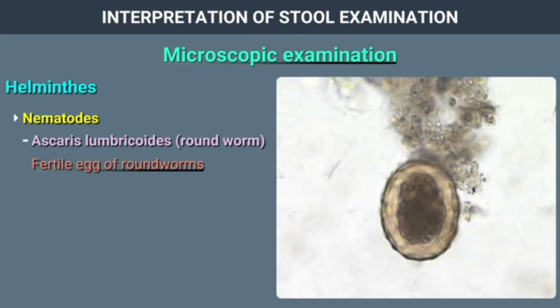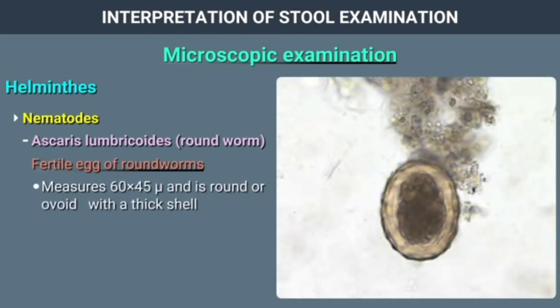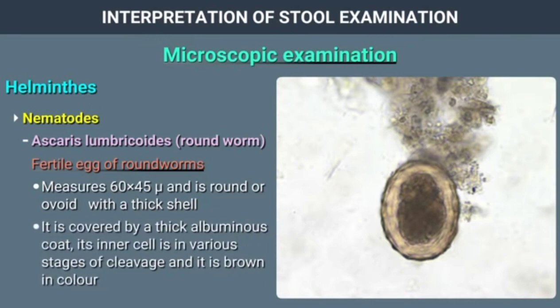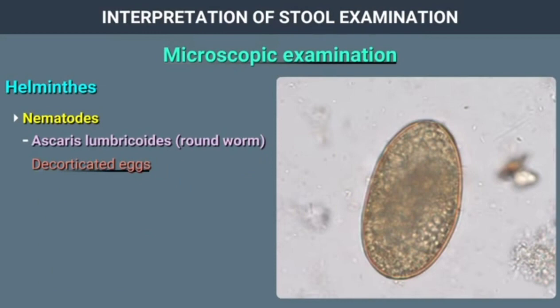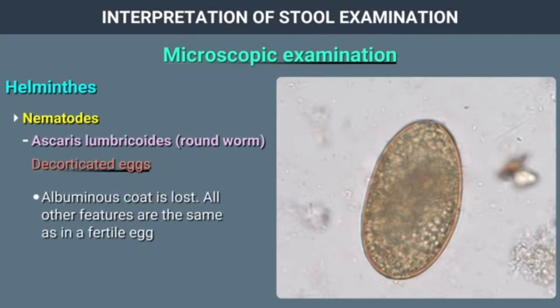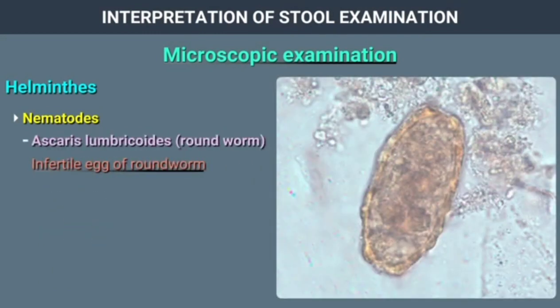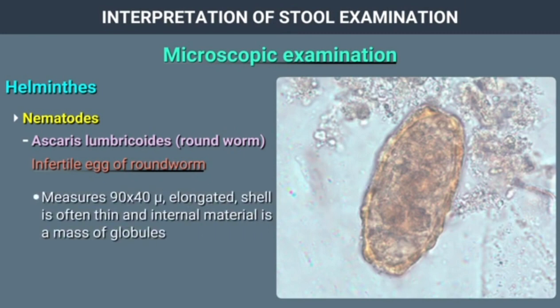Ascaris lumbricoides (roundworm): The fertile egg measures 60 by 45 microns. It is round or ovoid with a thick shell covered by a thick albuminous coat. The inner cell is in various stages of cleavage and is brown in color. Decorticated eggs have lost the albuminous coat. The infertile egg measures 90 by 40 microns; it is elongated, often with a thin shell, and its internal material is a mass of globules.